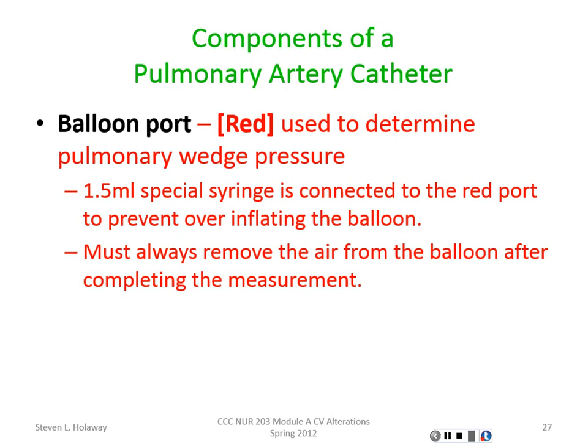When at the very end of diastole, this valve is open, I can actually measure the pressure here in the left ventricle because this whole system is open from here all the way to there. And that's what a wedge pressure is. A wedge pressure is measuring the pressure indirectly from the left ventricle. And by knowing what's going on in that left ventricle, I can see how well that heart is functioning. That's really what this pulmonary artery is about.